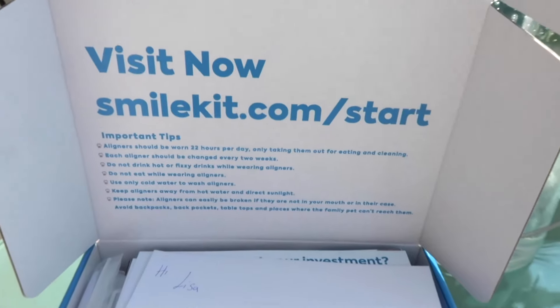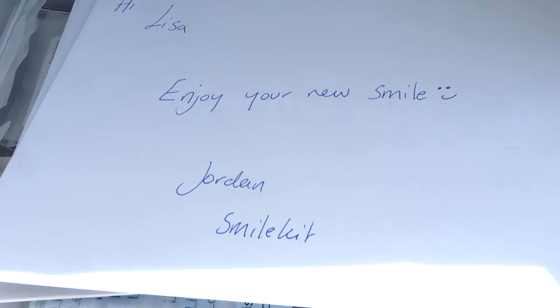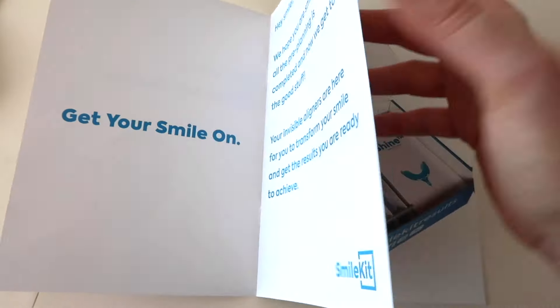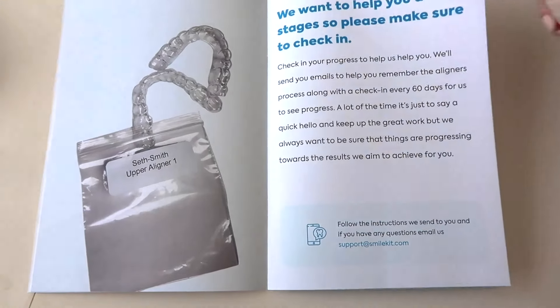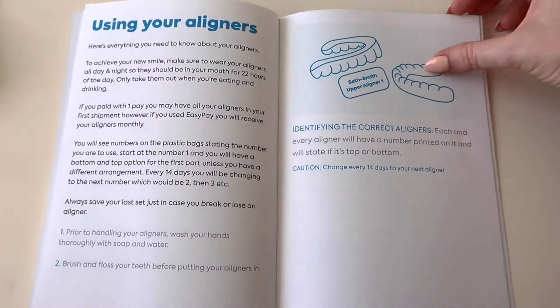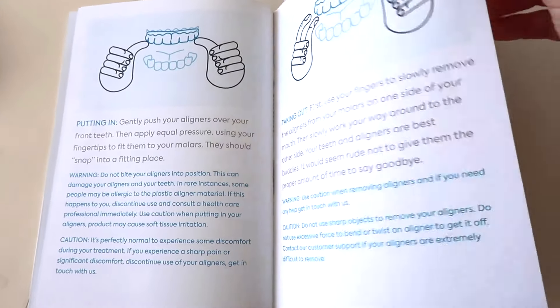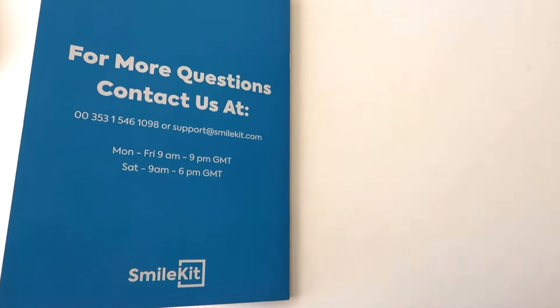When you open the box you will have your information here. I've got a nice little note and then an invisible aligners guide, which I will take you through slowly. I've filmed this up close for you to see because it tells you interesting facts - like washing your hands before you handle them, and making sure that every time you eat you take them out, clean your teeth and floss before you pop them back in.